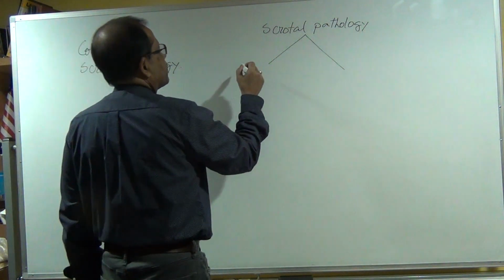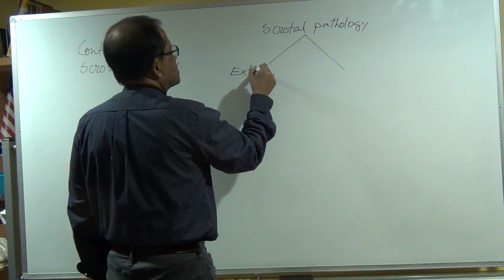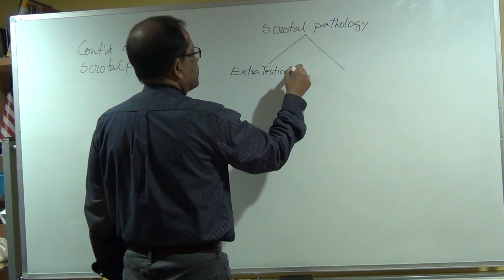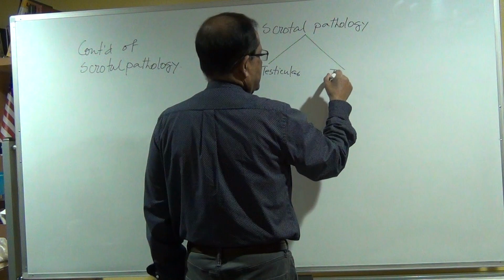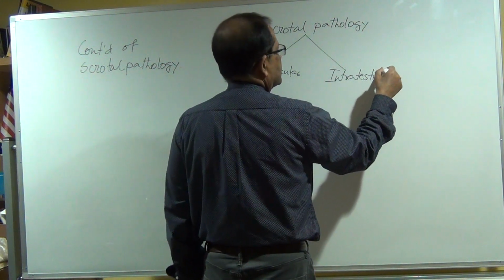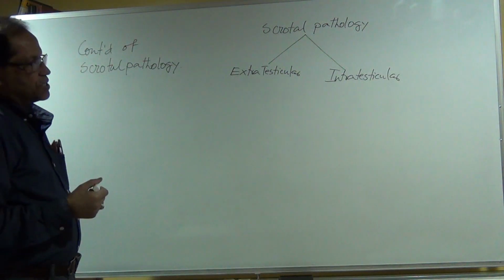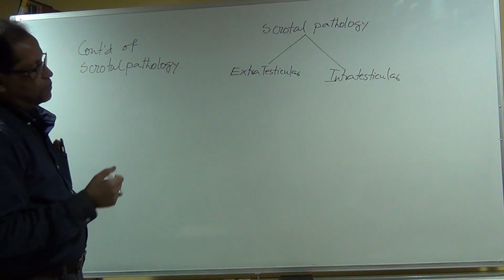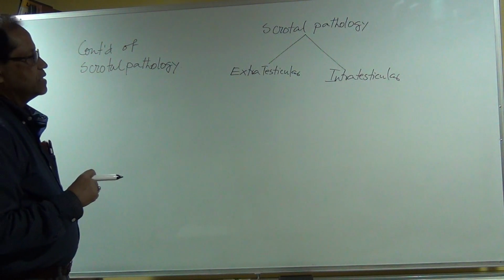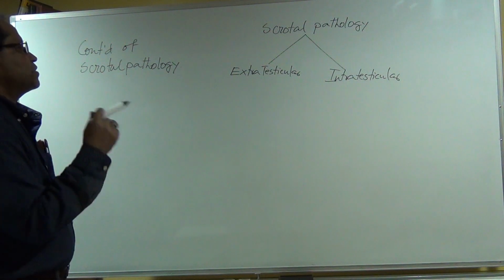One is extra-testicular and intra-testicular. The extra-testicular means the pathology, whatever the pathology it is, not touching the testis. It is extra-testicular.